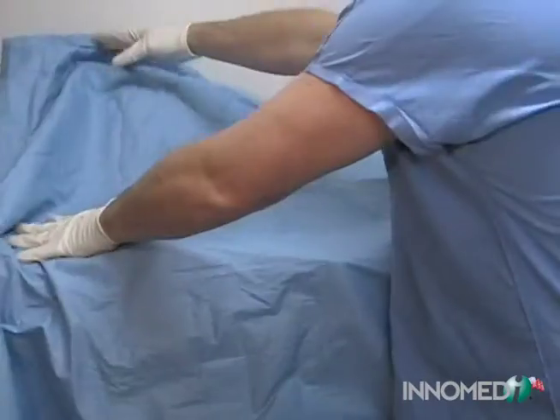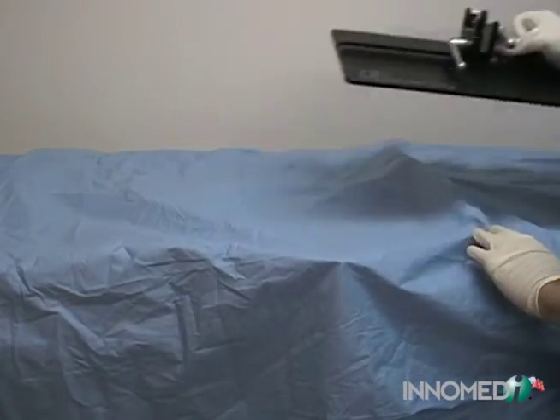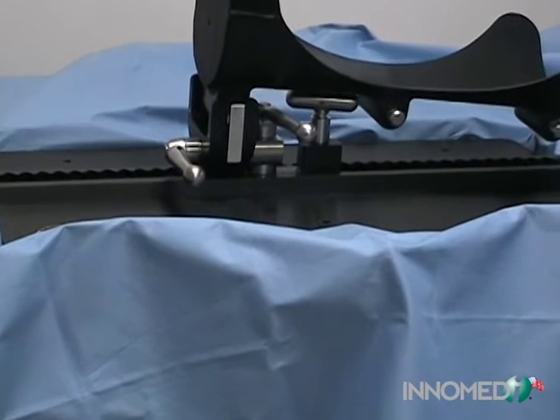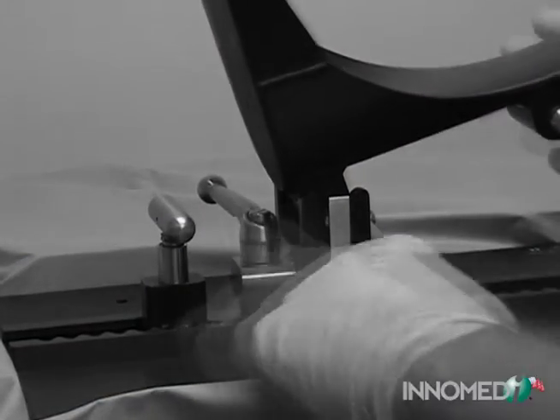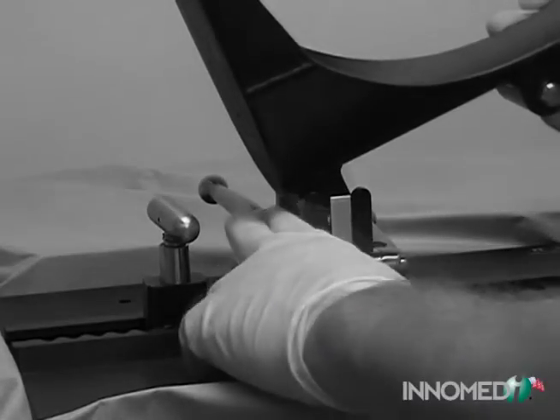The base plate is draped and the support plate inserted. The support plate should be placed into the base plate so that the rotation bar will not interfere with the foot support. The rotation and ratchet bar should be proximal in relationship to the patient. The correct orientation will help to avoid any unintended contact between the foot support and the rotation handle.